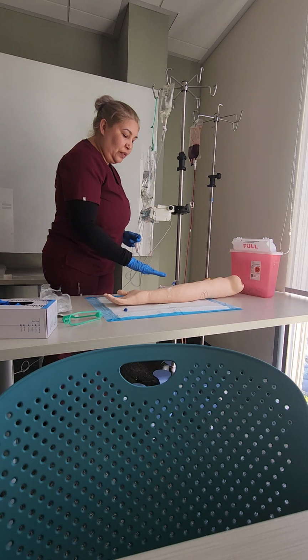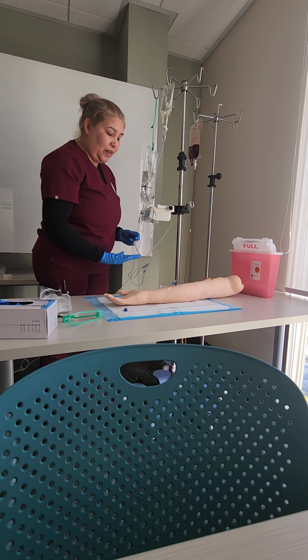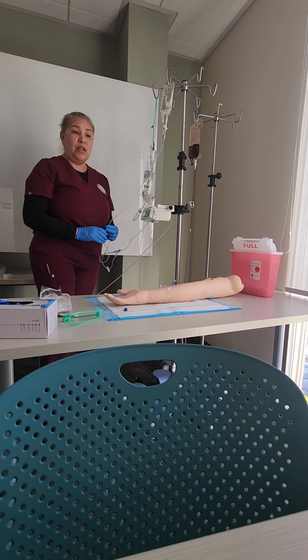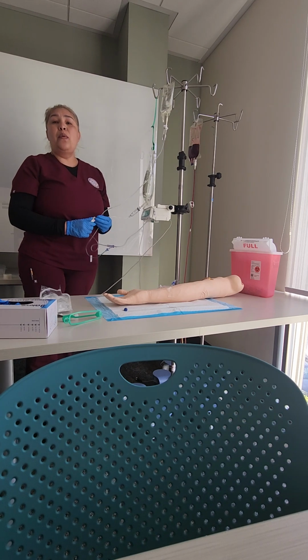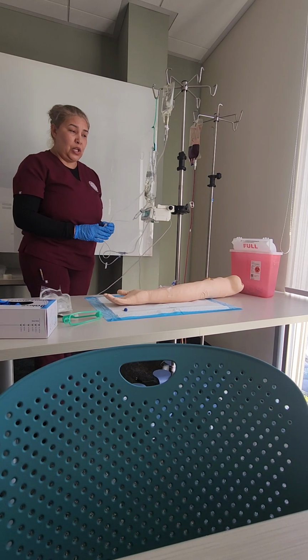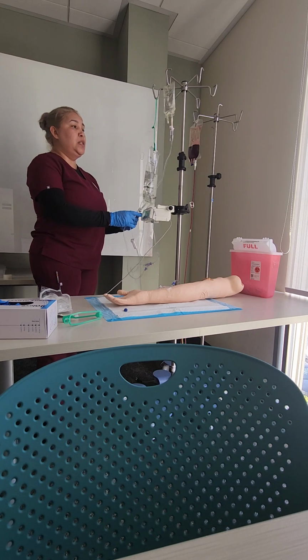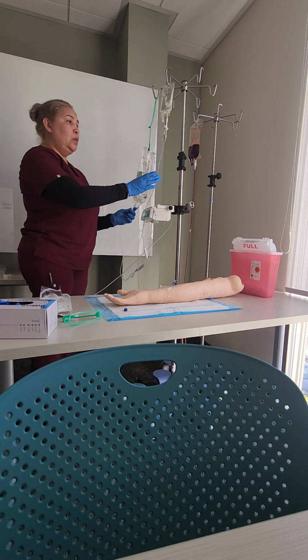What I want to do now is assess the site. I want to make sure that the fluids are going in, that there is no puffiness, no redness, no swelling in the area, that the patient is tolerating it okay. I want to ask my patient if there's any pain. I want to ask my patient if they are tolerating it okay. My patient said yes.